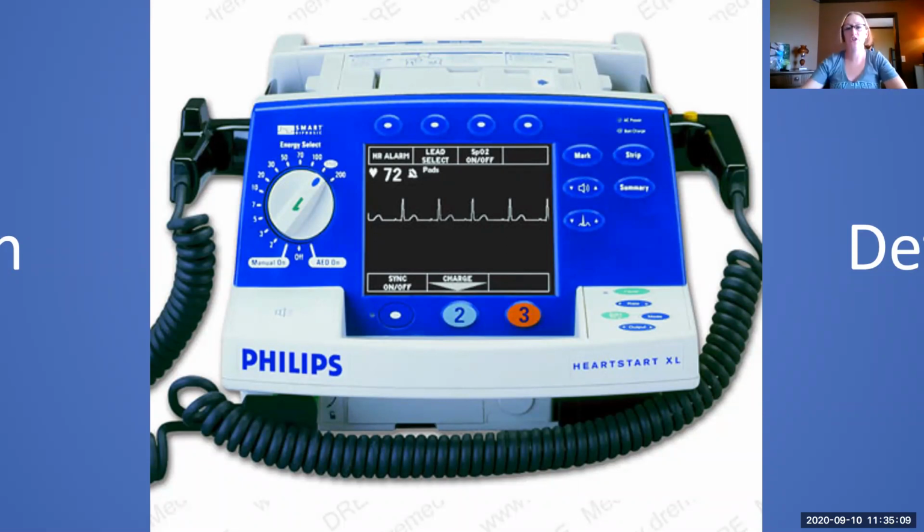Then you're going to charge it. And then after it's charged, this button right here is your shock button. And then you'll push your shock button, which what do we always do right before we shock a patient? What do we always need to make sure? Nobody's touching the patient. Yeah, everybody's clear. Not touching the bed either, because the impulses can go through. So making sure everybody's clear, and then you shock them. So then it will shock them on the QRS complex that needs to be shocked.